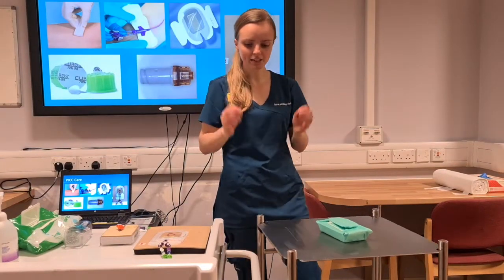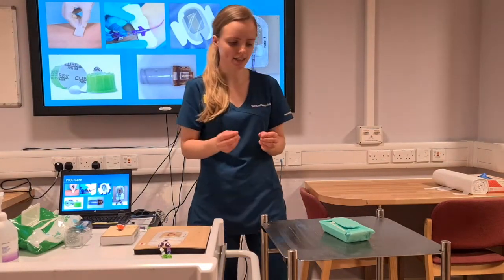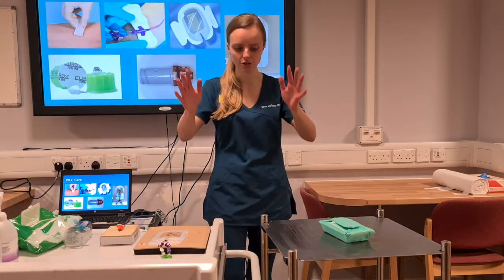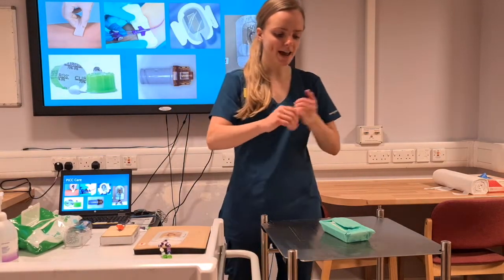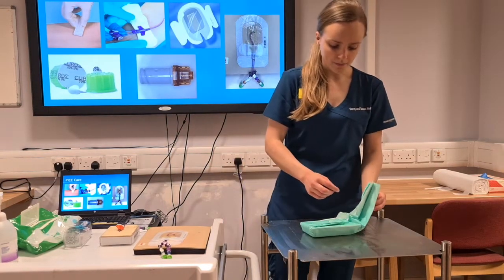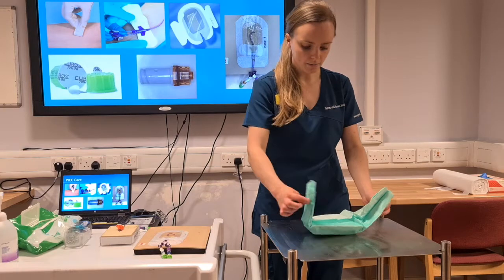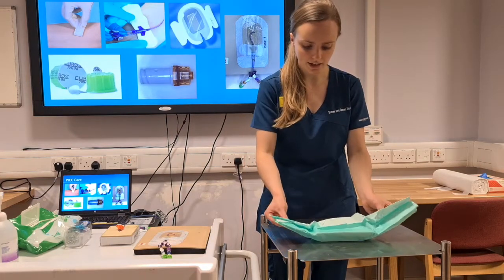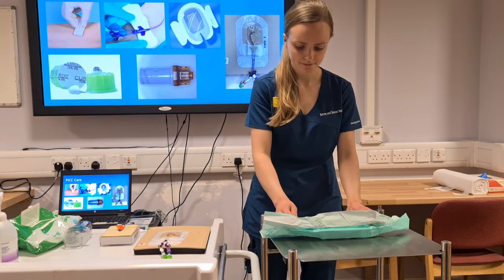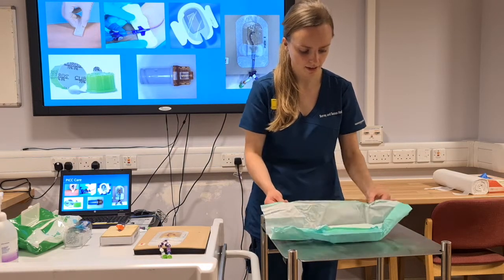This is an example of surgical ANTT. I've shown you how to do standard ANTT with your IV, protecting your key parts. Now everything on my sterile field is going to be sterile. So I'm going to open it up, making sure I'm not touching the inside of my sterile field. That's it, opening it up.